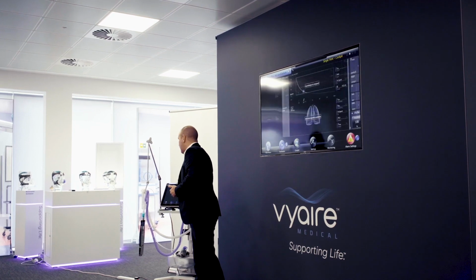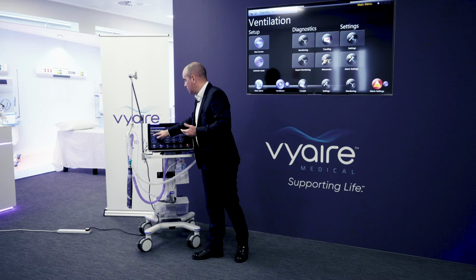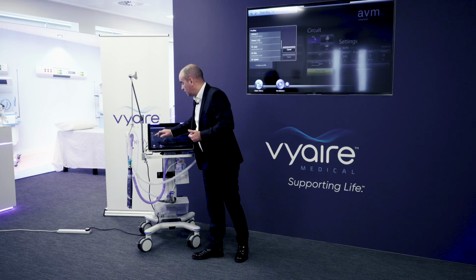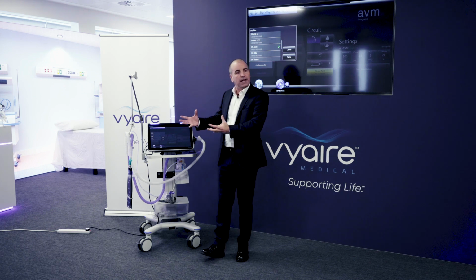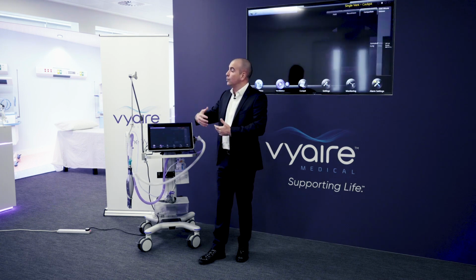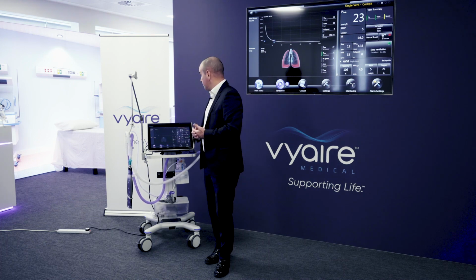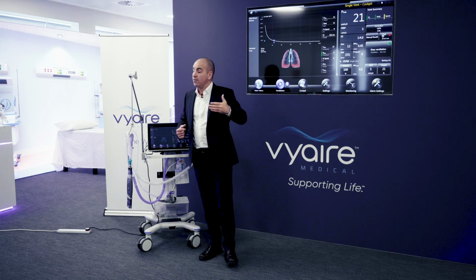Okay. So now when the patient is being admitted under your care, for instance, there's no doubt in terms of what they're going to do. You have up to 20 profiles to choose from. Dr. Joan likes the device set up that way, likes to ventilate in that way. That's the recipe that she likes. Then everything is set up and ready to go the way you like it for your patients. You can label it disease-specific, doctor-specific, department-specific, whatever they want to call it. It promotes standardization as to how the data is presented and how the ventilator behaves out of the gate.